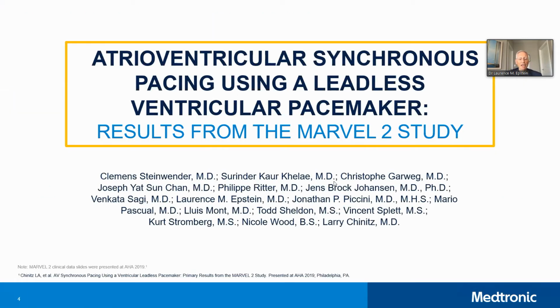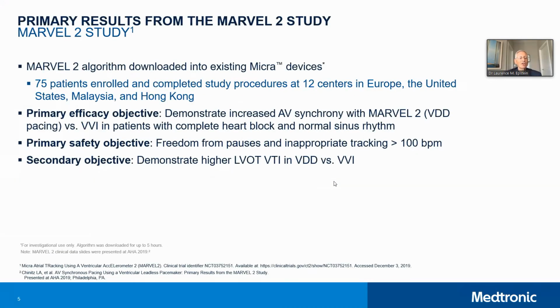So this study was published a couple of years ago and led to, at least in the United States, the FDA approval of this device, even though it wasn't in the actual Micra AV device. Next slide. So the goal of this was to look at the Marvel 2 or the Micra AV algorithm.